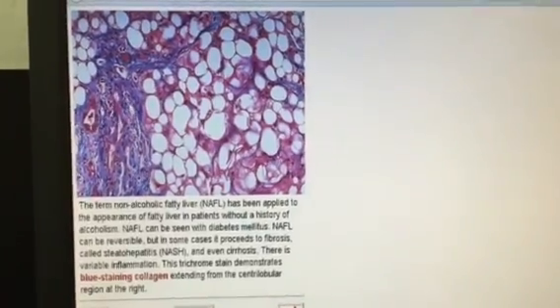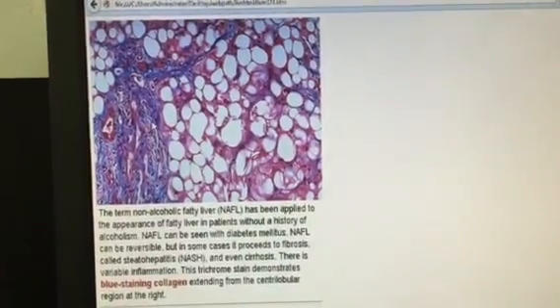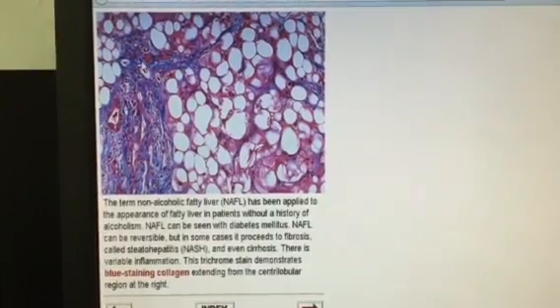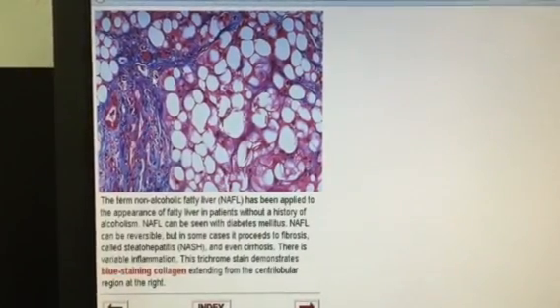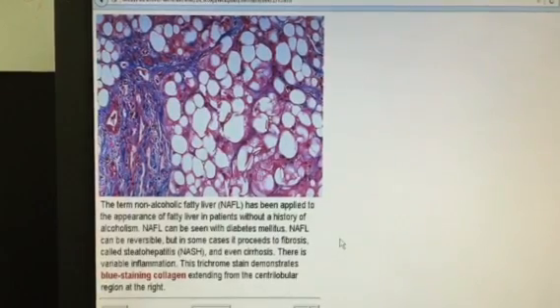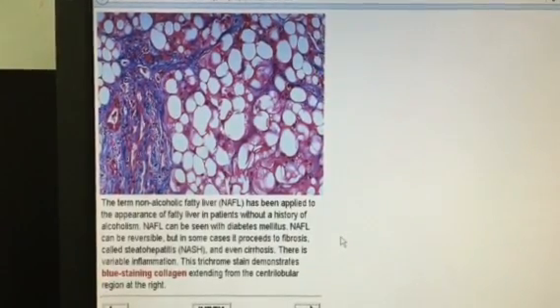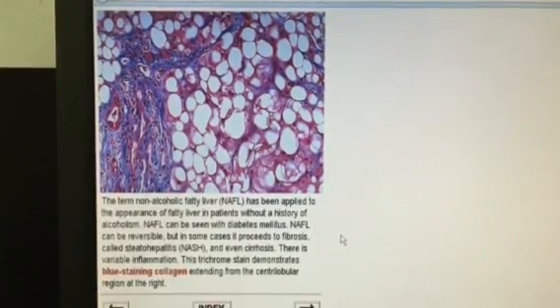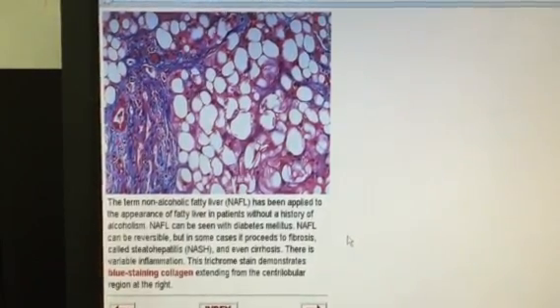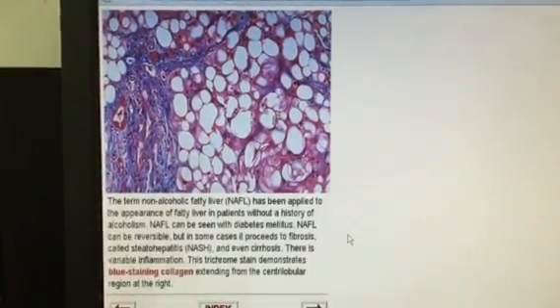This is a trichrome staining that is staining the collagen. So this indicates fibrosis of the stroma. It's blue in color. Why fibrosis? Because fatty liver can lead to fibrosis, and fibrosis will lead to cirrhosis by many years of fibrosis.